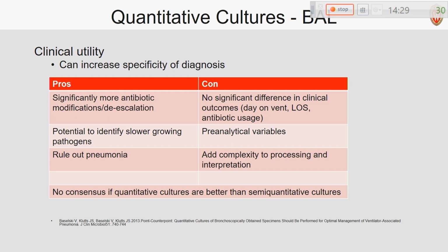So it's got to be above the threshold. I don't know, can anybody confirm that? But my recollection is that it has to be an opportunistic pathogen that might be involved, your strep pneumos, H. flus, Moraxellas. Okay. And above the breakpoint. And then the other stuff, no. Okay. That would just be lumped in as normal flora then? Yeah, pretty much.